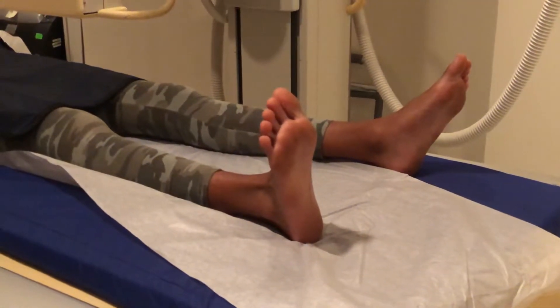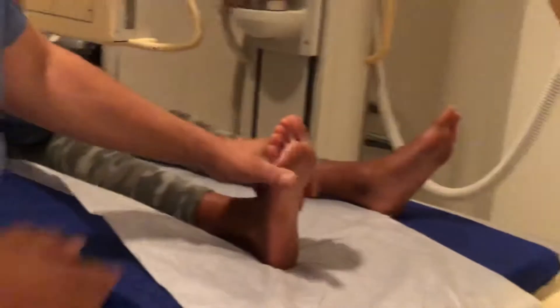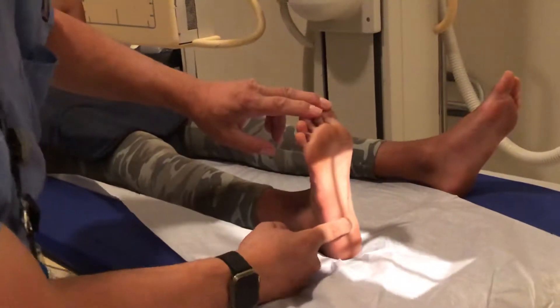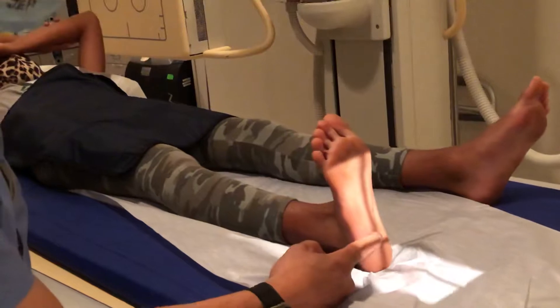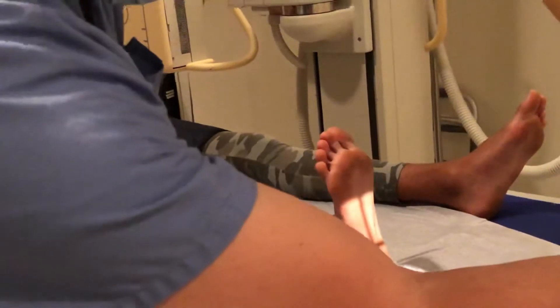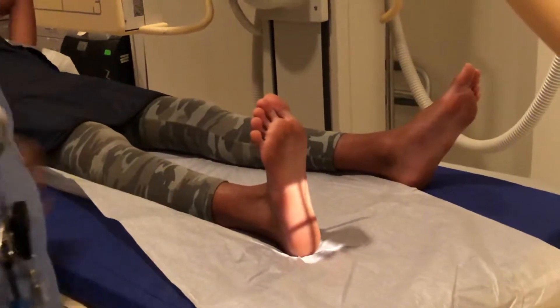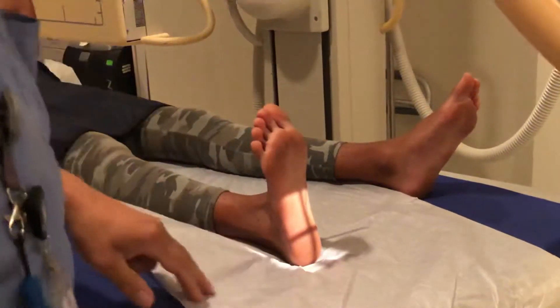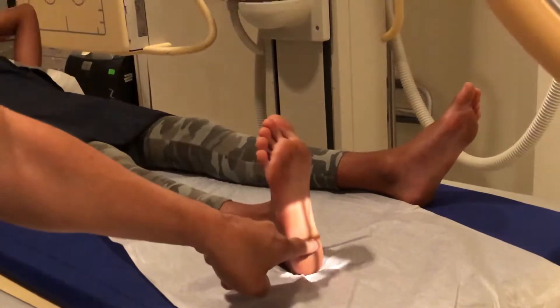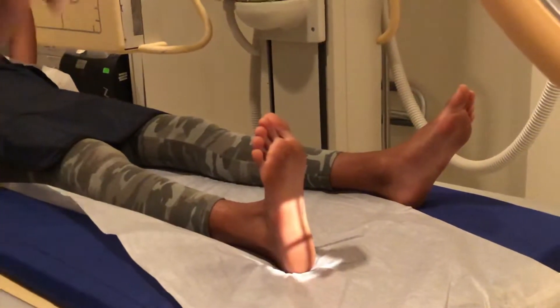So the axial — the way we set up for the axial is we put a 45 degree angle on the tube. We have the patient flex their foot back as far as they possibly can, and we're going to enter right here, kind of at the midpoint where the heel is. Have them be straight up, and for this you can come down pretty tight because it's just all air on the outside. So as long as you have light on each side you'll be fine. Foot is flexed all the way up, and you're going to center right here, midway between the base and the top of the os calcis — so that's the first view.